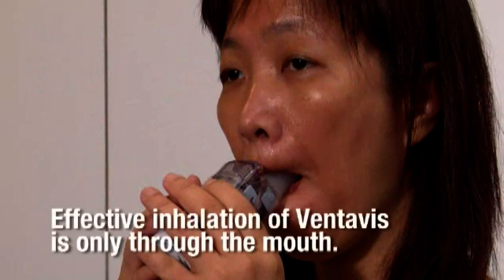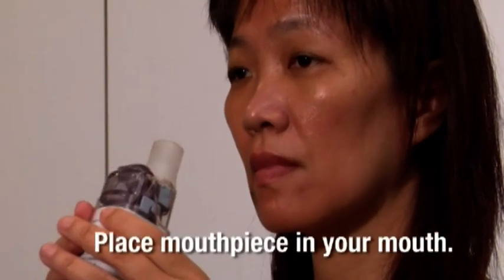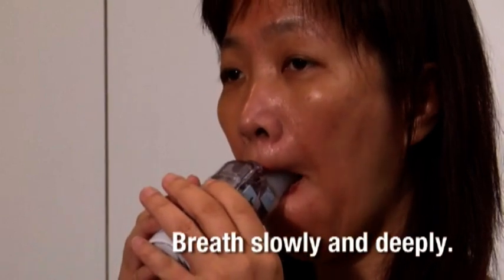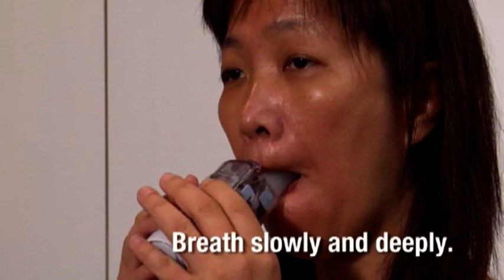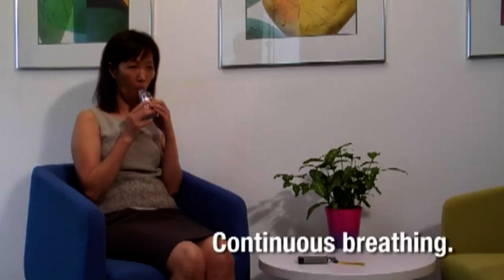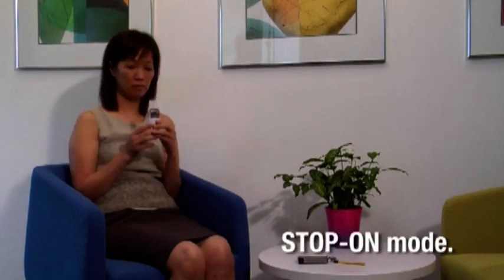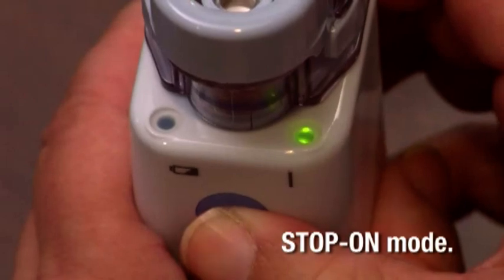Effective inhalation of Ventavis is only via the mouth. Install the mouthpiece, place it in your mouth, and breathe through your mouth. Ensure that you breathe slowly and deeply — it is best to inhale with long, deep breaths. You can inhale in two ways: continuous breathing — switch the nebulizer on and take slow, deep breaths until the medicine is finished; or stop-on mode — switch it on, breathe slowly and deeply, switch off when you exhale, and repeat the cycle until the medicine is finished.